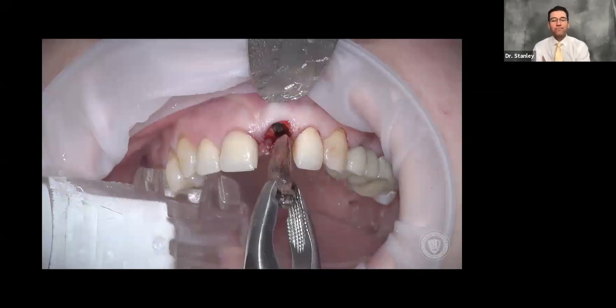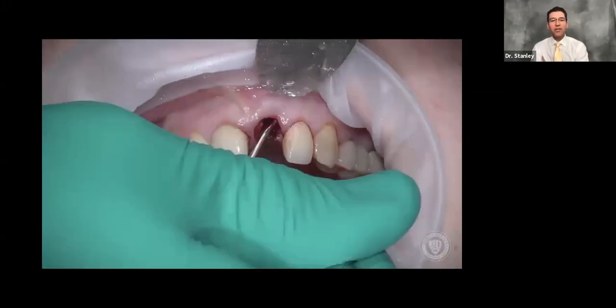Here's the tooth coming out. Then the next thing we do is clean out the site. I use a curette recently launched by Hu-Friedy that has serrations on it — if you don't have one of these, you've got to get one. They're inexpensive and wonderful. If you've ever used a curette, sometimes you get one of those granulomas and you're picking at it forever trying to get it out of the socket. With the little teeth on this serrated curette, it allows you to grab onto those slippery pieces and get them out of the extraction site. It also helps to score the periosteum and score the lamina dura.